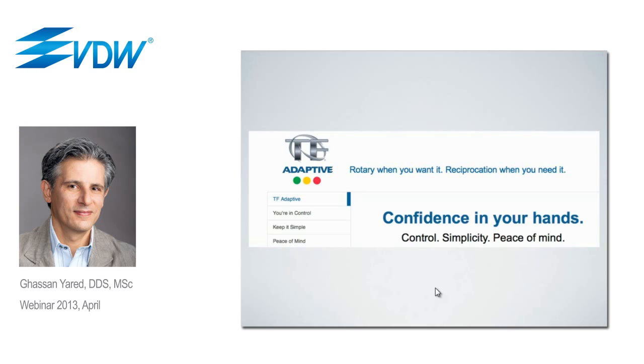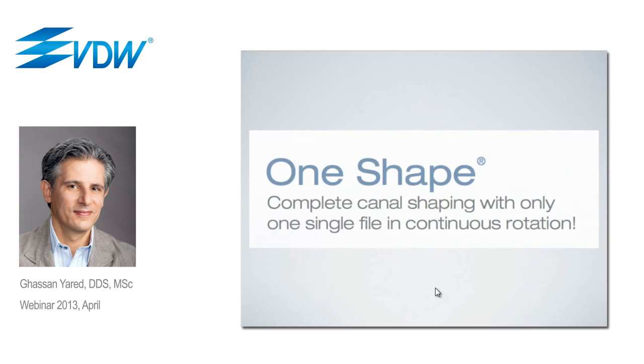What does that mean? That means in the difficult cases, in the curved canals where there is stress on the instrument, reciprocation is needed. And this, in a way, proves the concept, the efficiency, and it proves the rationale of single file reciprocation. So in this case, they are using reciprocation when the case becomes more difficult. So the question is, why do we want to use a rotary system also in reciprocation when we can obtain a safer result with using only single file reciprocation?